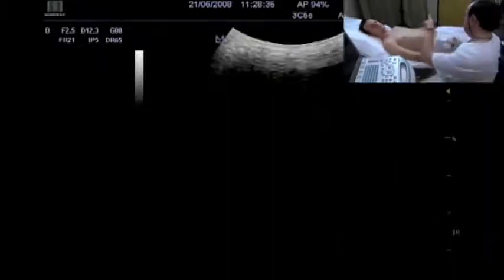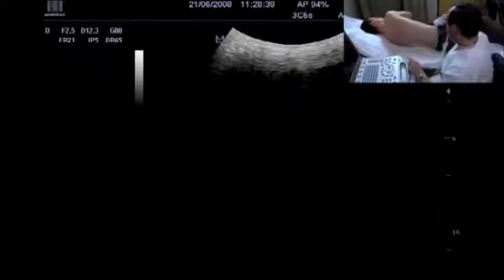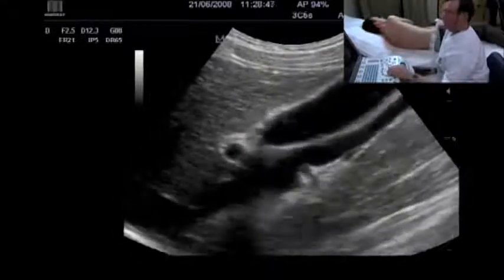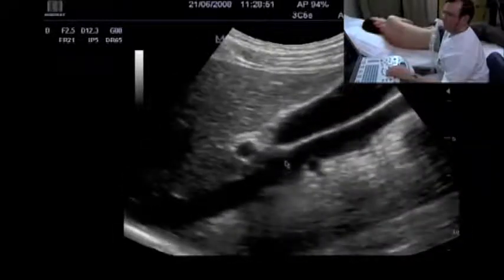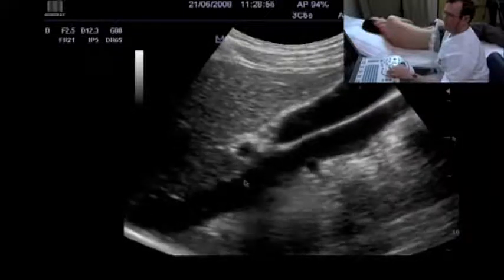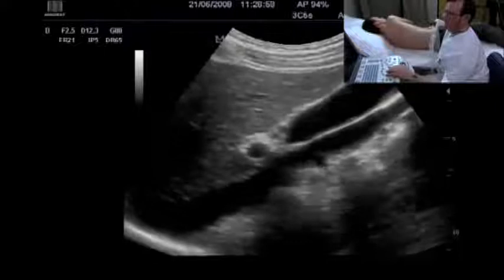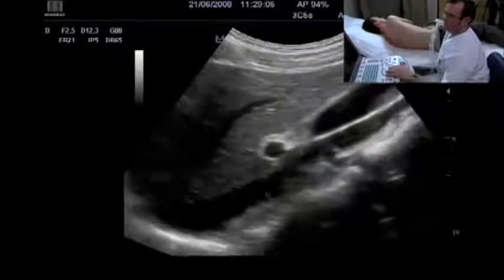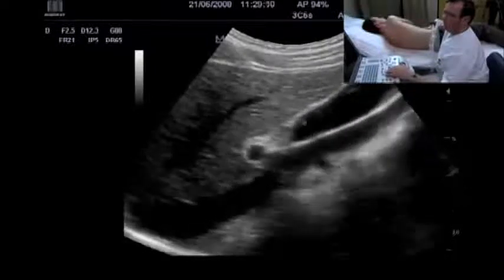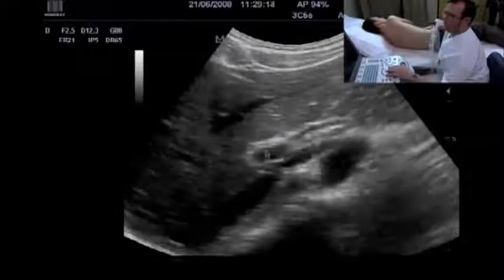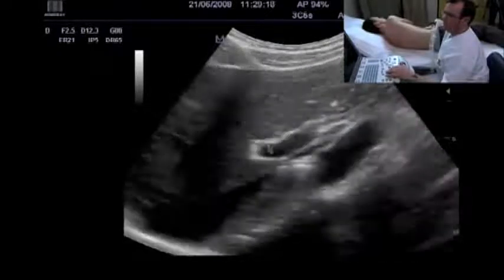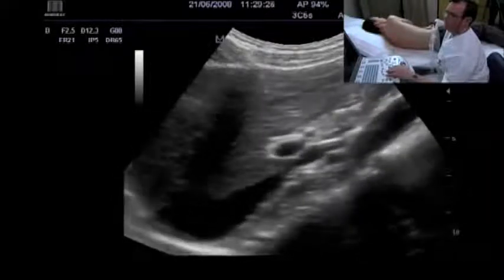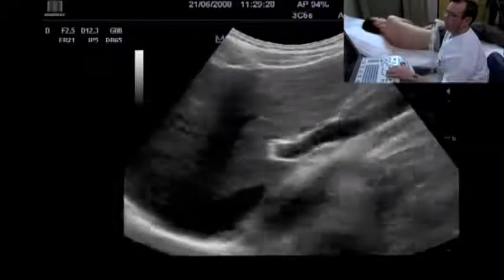We ask the patient to move to the left side and then perform a subcostal examination — this is the ideal position to visualize the liver hilum. What we can see here is the cava vein with the cross section of the right renal artery, which runs behind it. Here is the portal vein, the gallbladder, and the different structures of the liver hilum. We can see the main bile duct and also a tiny vessel, which is a branch of the hepatic artery.